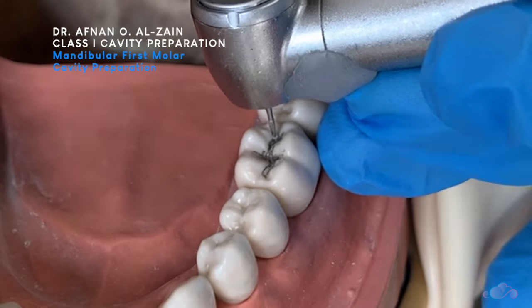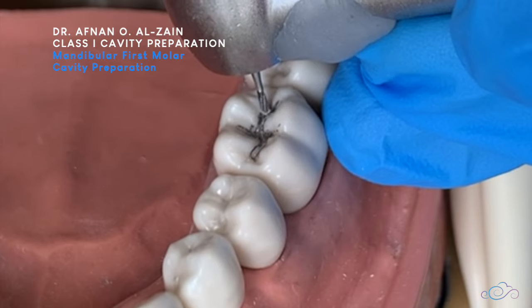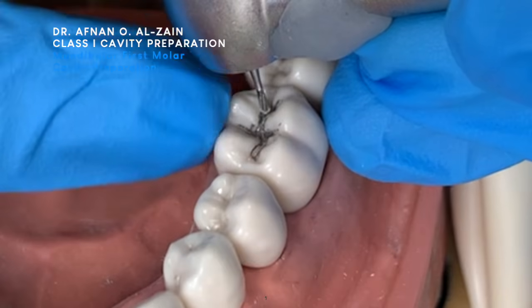We are going to place the bur perpendicular to the tooth surface. And we are going to place the head of the handpiece so that the head of the handpiece is perpendicular to the tooth surface.